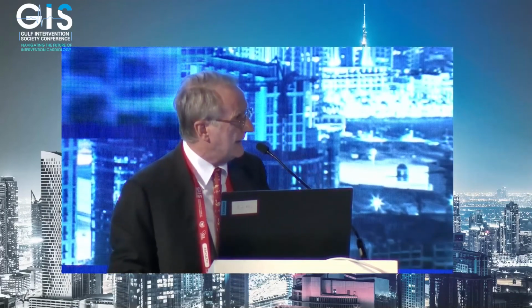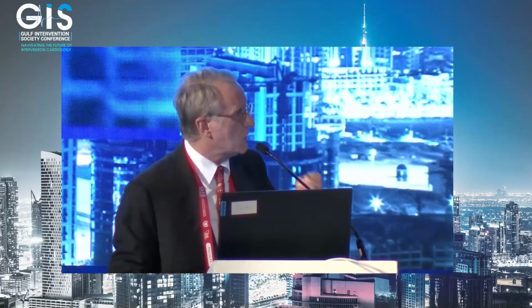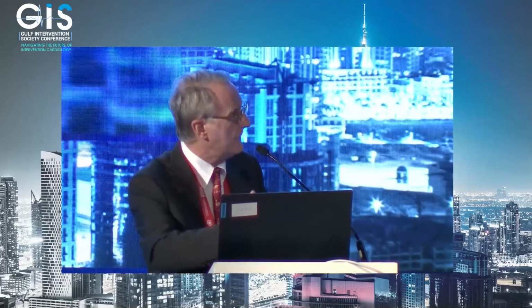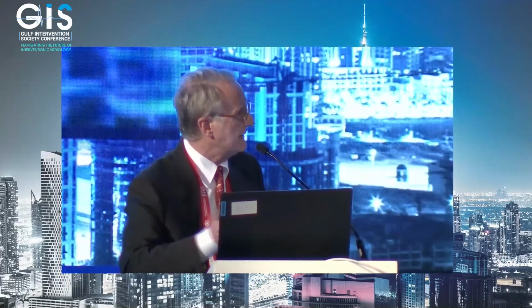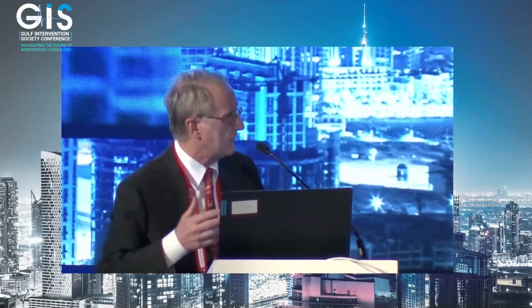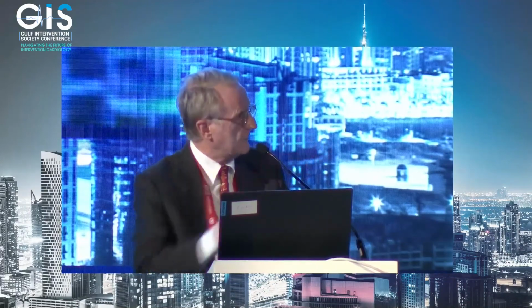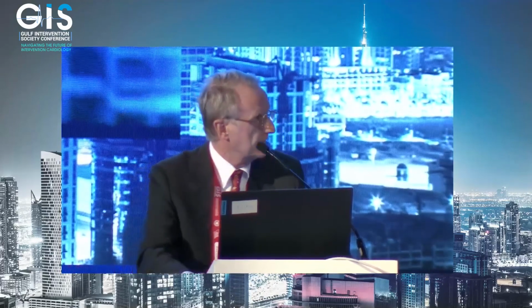There are some lesions where, if the result is good and stable, you may not need a stent. But we need to show that there is an advantage. In the left main I showed you, there is an advantage immediately because it took half an hour, instead of placing a stent, you triple inflations, etc. In some other situations, maybe there is no advantage, but it's going to take 4 or 5 years before answering all your questions.